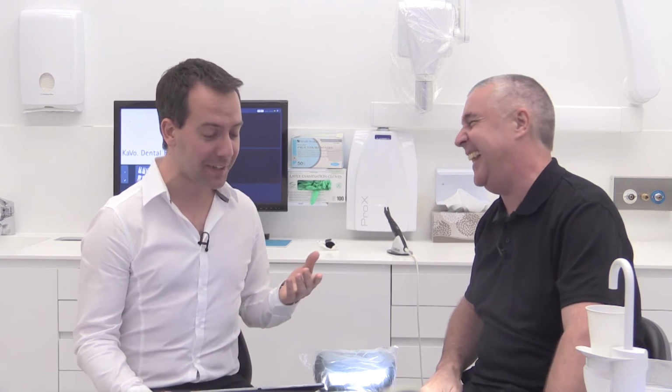Sounds good to me. Another good question, when teeth overlap, in terms of their alignment, it can be really difficult to assess them on a bitewing. Absolutely. Is the DIAGNOcam of any help with that? Does it also struggle with overlapped teeth? No, I mean, you've played with this long enough as well. You would have found this.